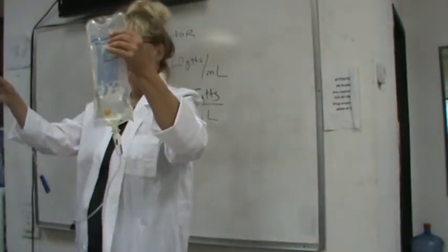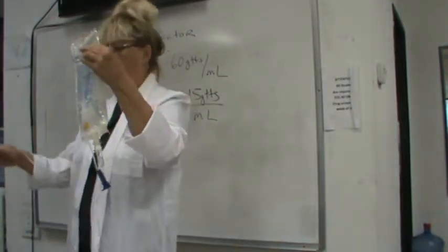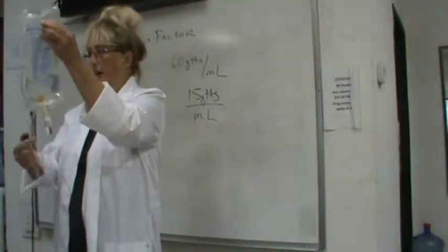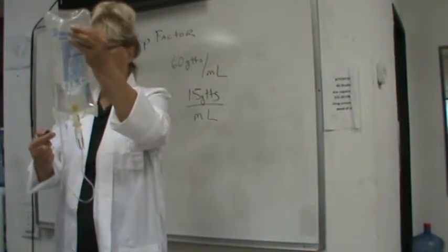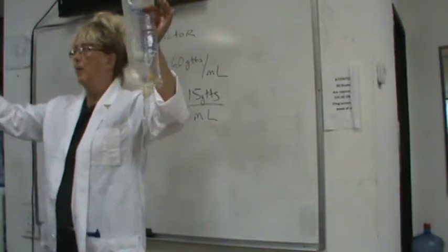We have to lock it, yeah. Keep this down. Lock it. Keep this piece down. Lock it, or you're going to lose all your fluid. Lock it from here. You should be able to look at your tubing and not have any bubbles in it now.